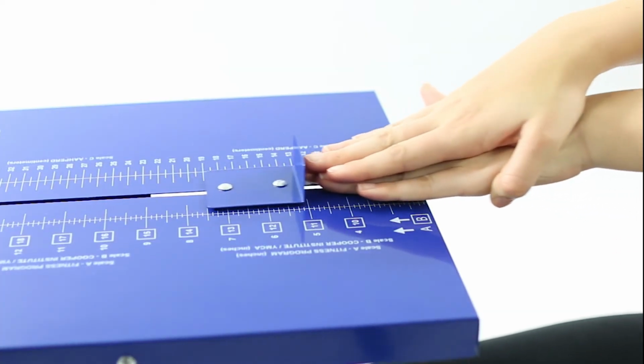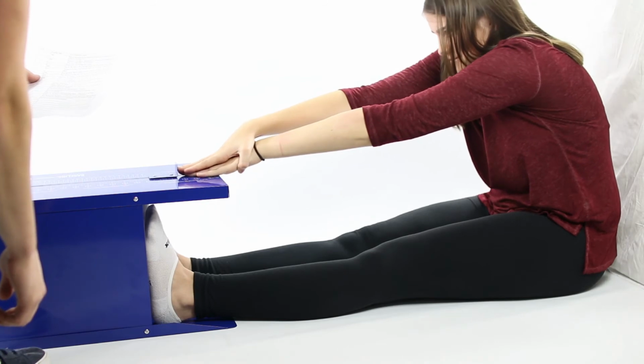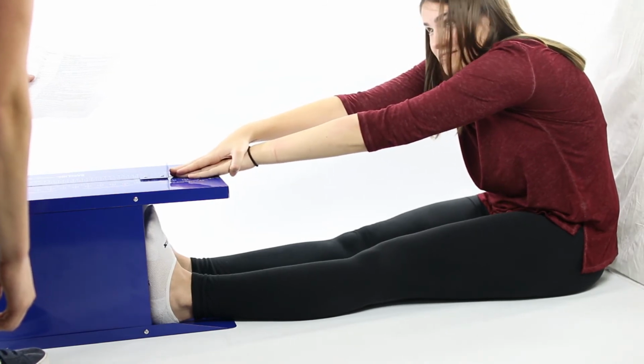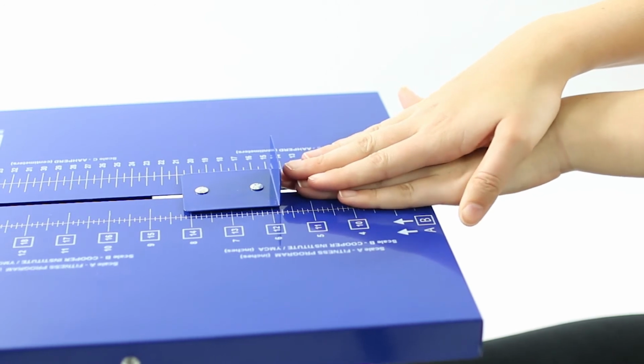While stretching, the subject should push the finger plate along the top of the tester as far as possible. There should be no lunging forward or any sort of momentum used to force the stretch. The stretch should be held for about 1 second.